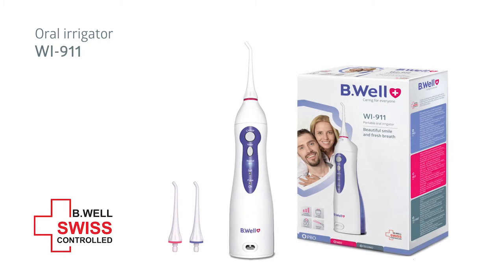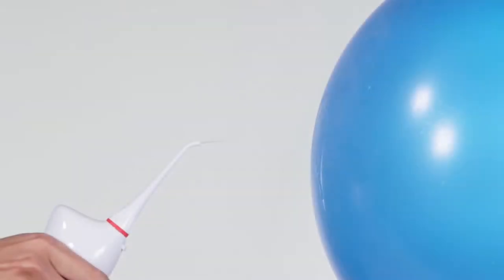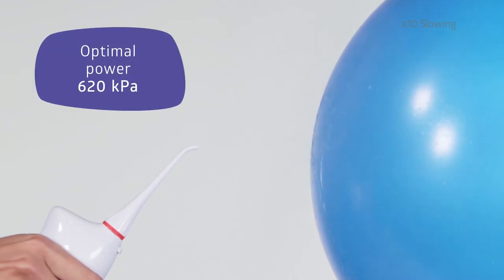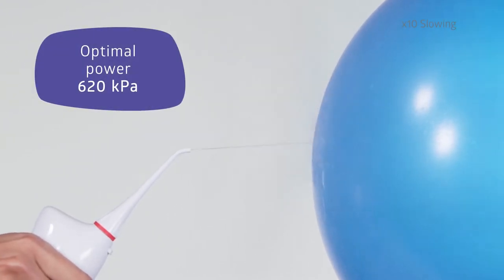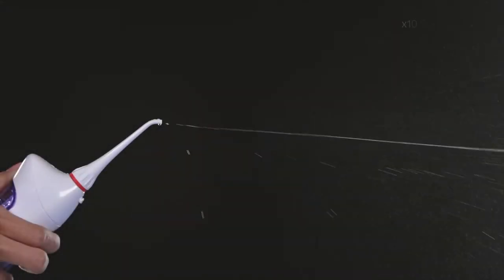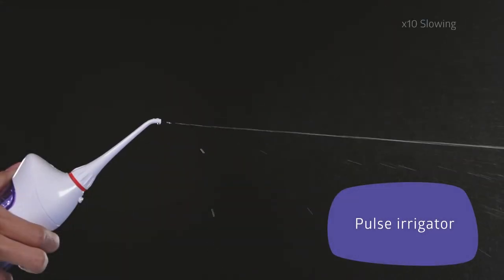The Be Well WI 911 Portable Irrigator will ensure your beautiful smile and fresh breath. The Be Well Irrigator is compact yet efficient. It has optimal power for complete teeth cleaning. The device belongs to the Pulse Irrigator category, the most efficient and reliable one.